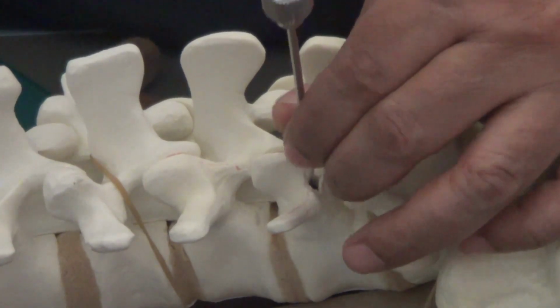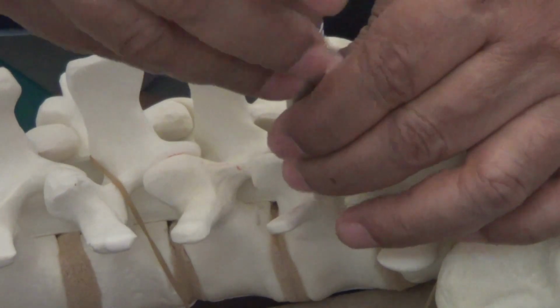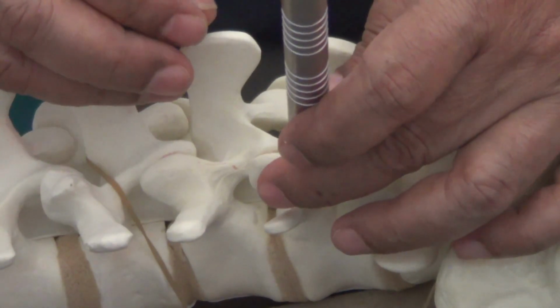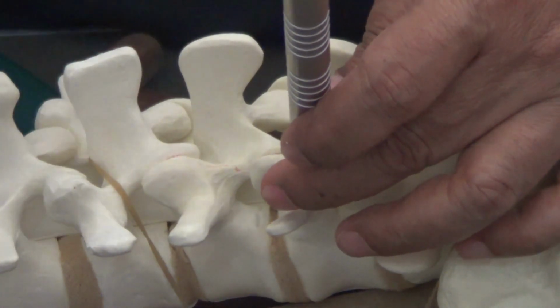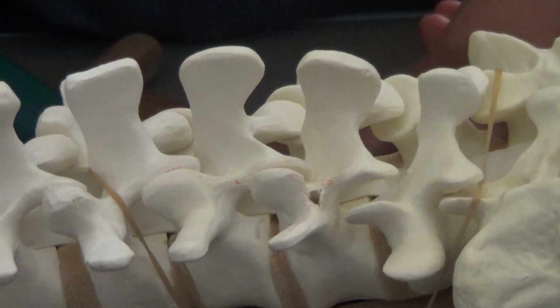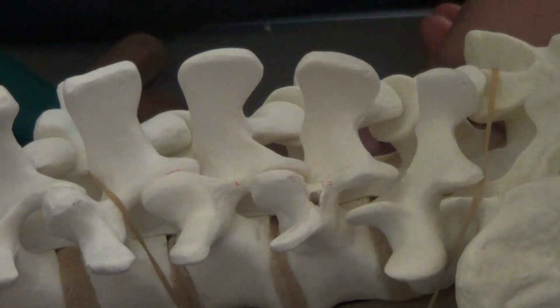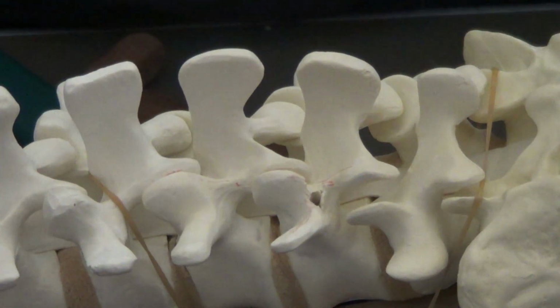And then you again feel for it, and sometimes you can feel the anterior border, and then you measure up the length of the screw, 40, right? So once you measure up the length of the screw, which is 40, then you select your screw. The size of the screw that you see is 6 by 40. Right, 6 millimeter, it's okay.